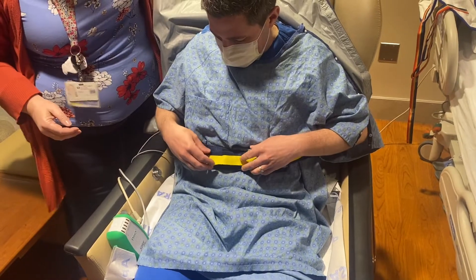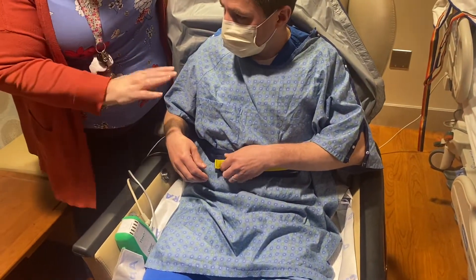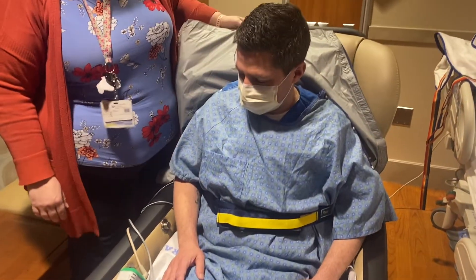So we're only going to pull that in case of emergencies, okay? Not right now. Thank you. Alright, Mr. Keith, don't forget — call, don't fall. Thank you.